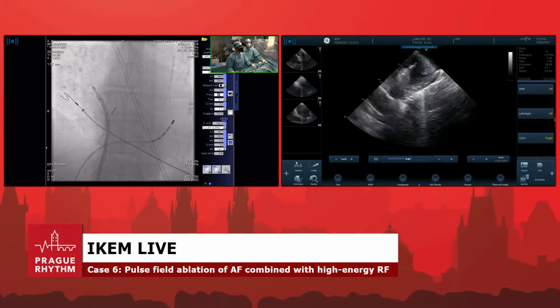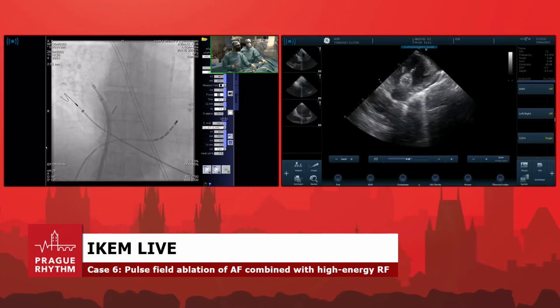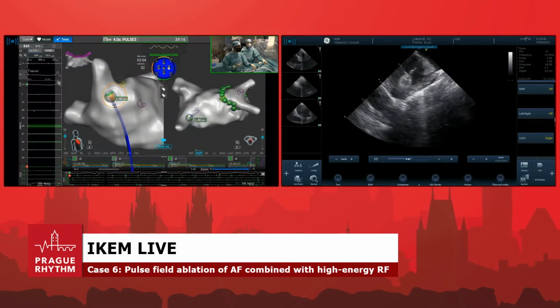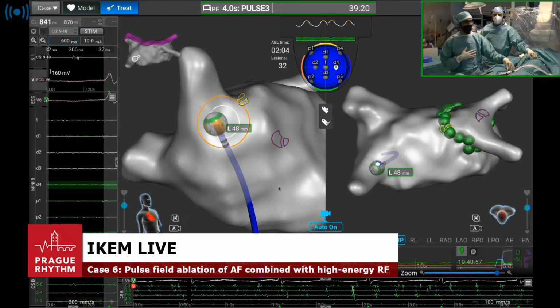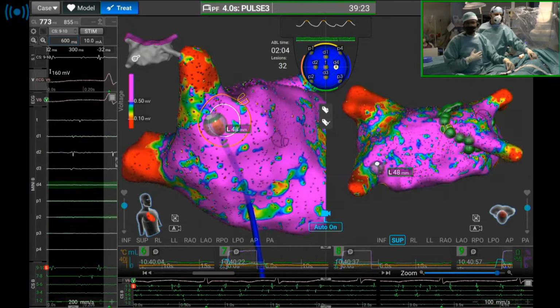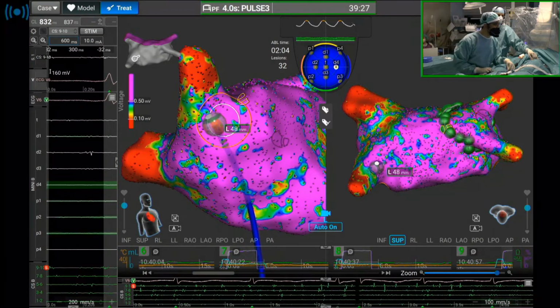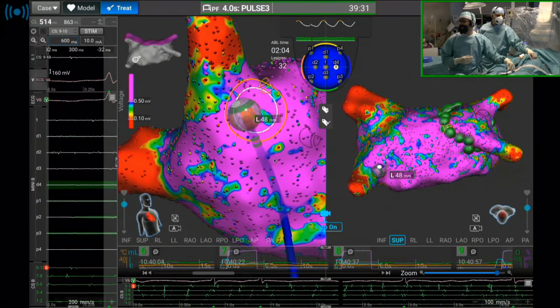Now, before you joined us, we mapped the left atrium and we did a voltage map during atrial fibrillation, and we're going to show you the voltage map. Wojtek, can you take us through the voltage map, please? Thank you. Okay, rotate. Maybe you can zoom in a little bit, because I also want to emphasize the high density and high resolution of this map.